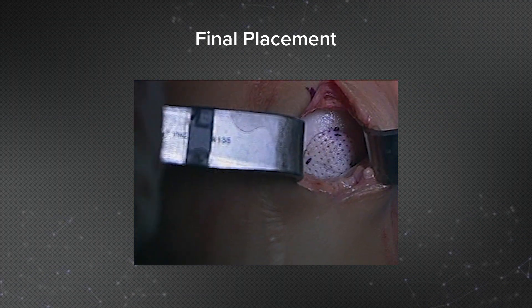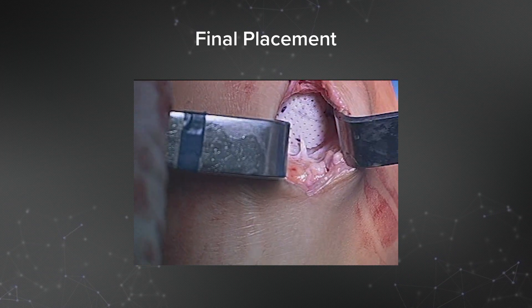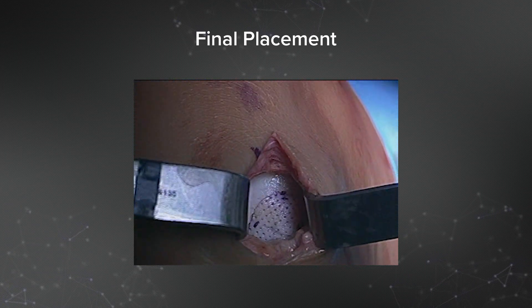Here's me ranging the knee after placement. You can see it's flush and not proud. There's no dimpling or kinking of the graft.